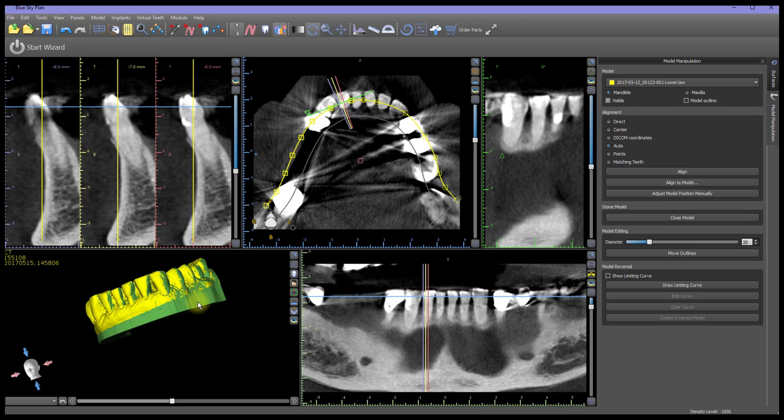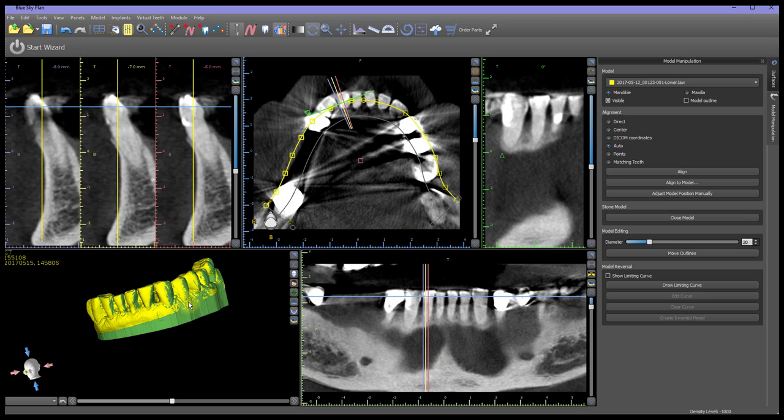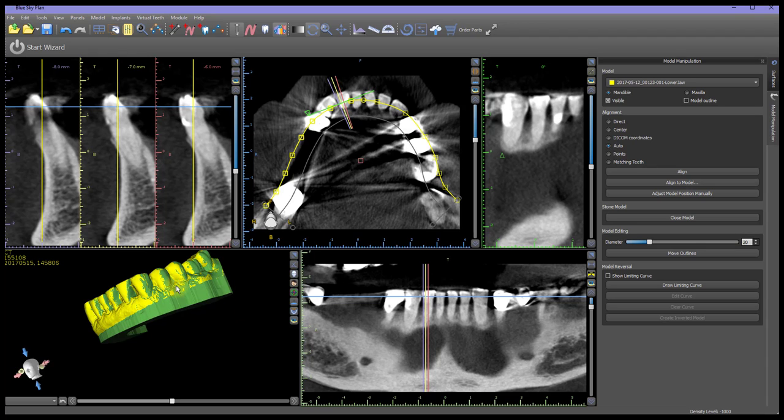The closed model is shown in green, superimposed over the original model, and provides a sealed base.